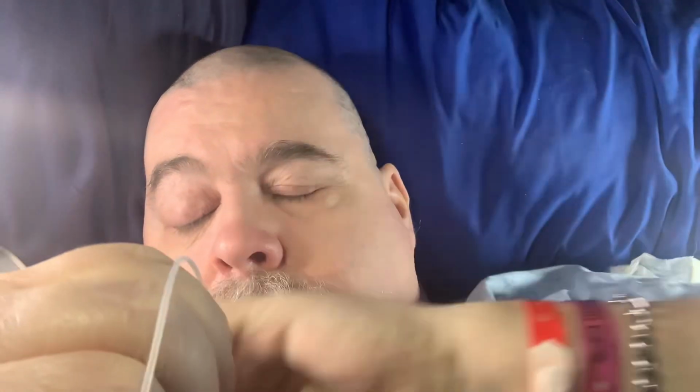Now, we're going to take a look at doing my insulin. Let's just get my pump here. Sorry guys, this is not a very good video. But current blood sugar is 5.2.